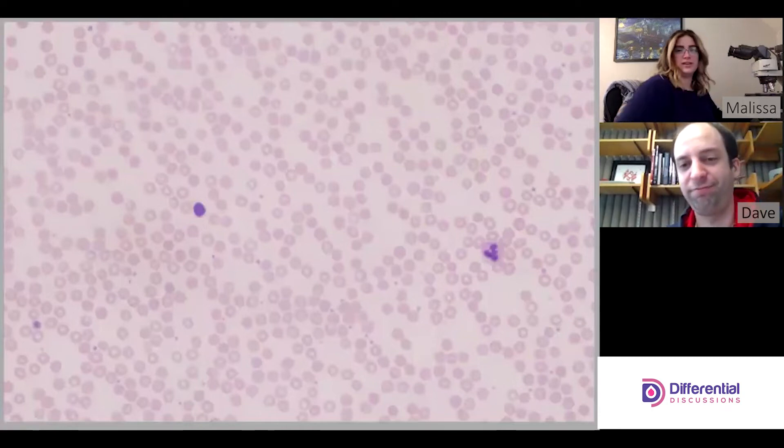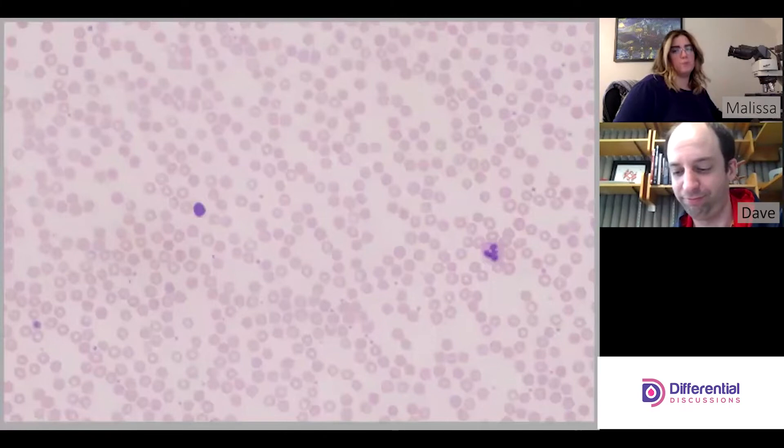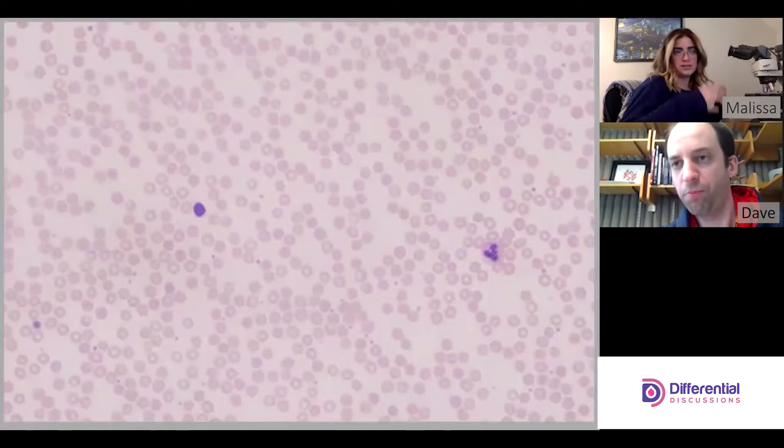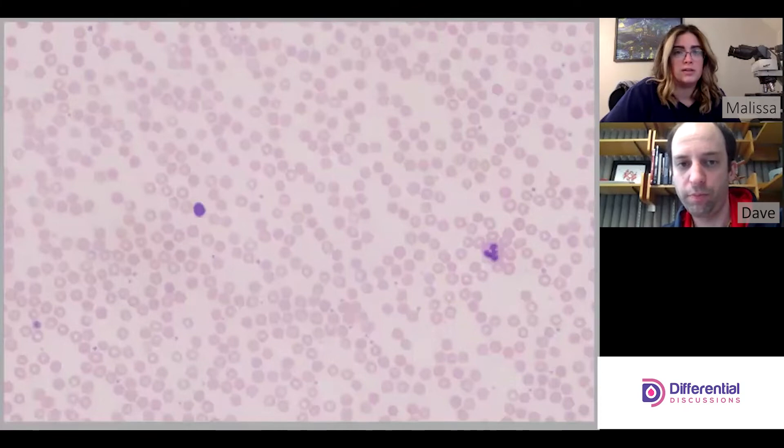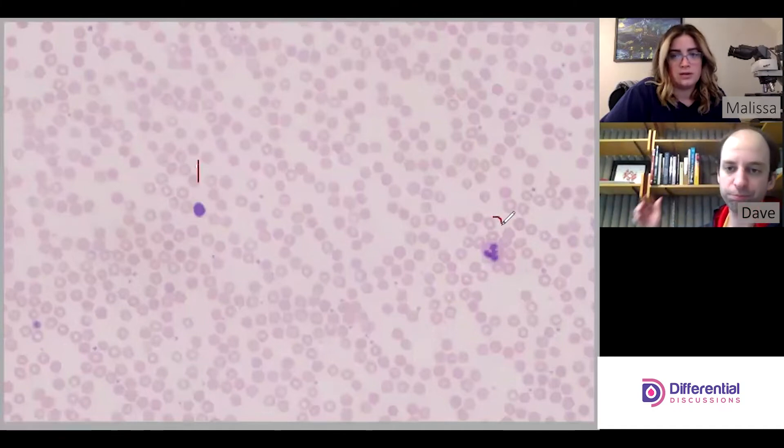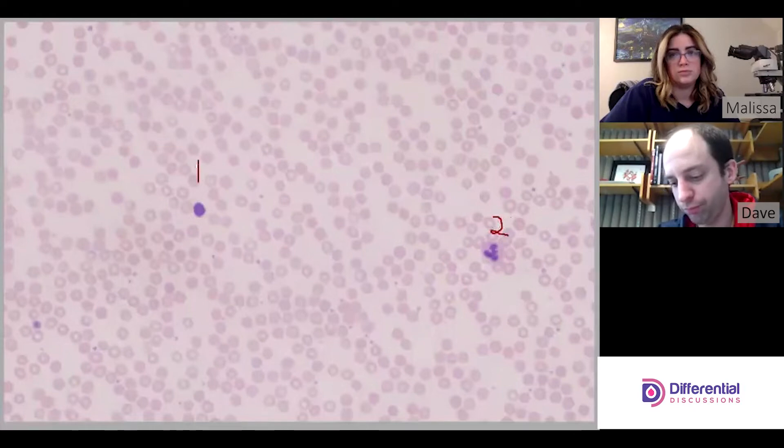All right, so in this field—mind you, we're doing this on 40x—so we prepped, found the field, here we are on 40x, and this is where we're starting. So this is our first of 10 fields. In this field that we have here, let me just pull up my little annotation guy so I can annotate it. We have one cell here and we have one cell here. Got it. So two in this one.